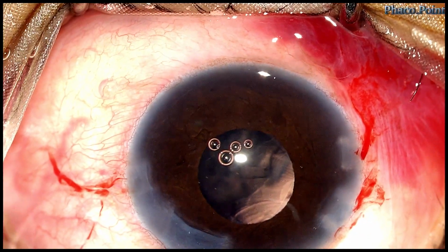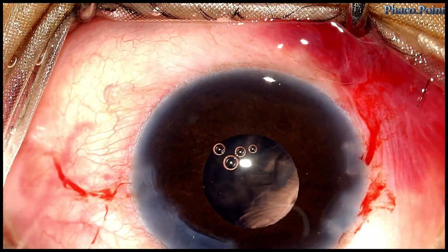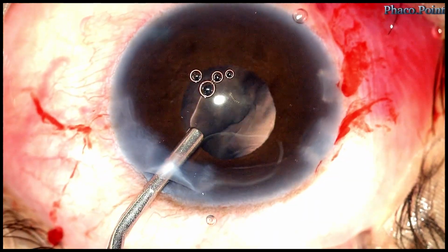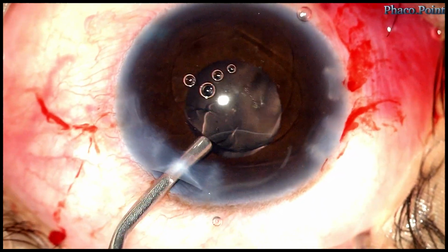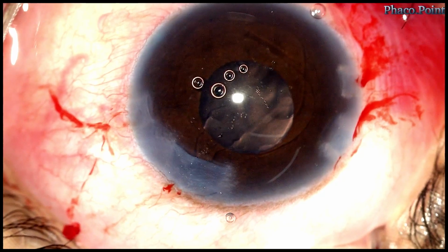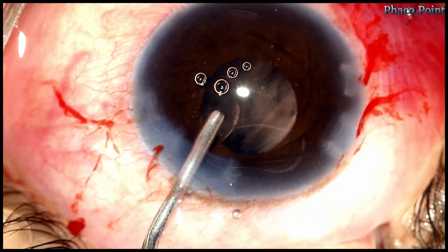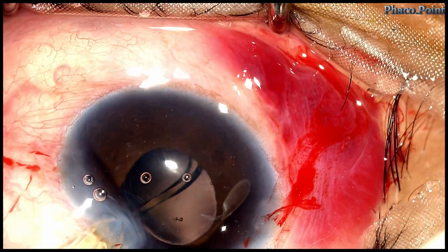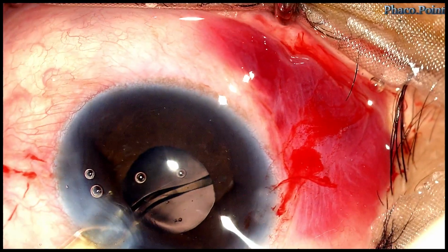We now proceed to the implantation of the single-piece monofocal IOL within the capsular bag. Why I chose a single-piece IOL is because this was a small zonular dialysis and I've achieved an equatorial stability of the capsular bag, in this case by implanting a CTR. Let's now watch the implantation of the monofocal IOL.